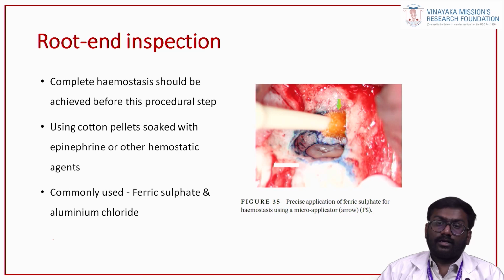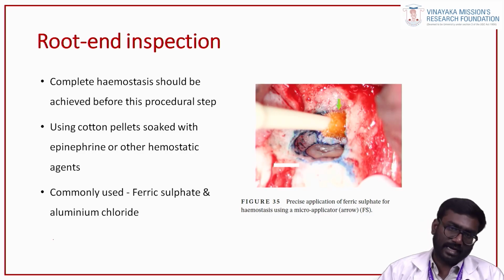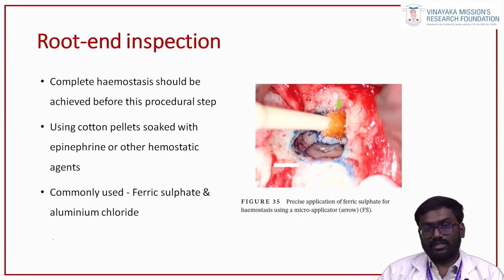So once the root end is resected and the cavity is curated, there should be no bleed. It should ideally be clean, so you can inspect that particular area. Complete hemostasis should be achieved before filling. You can inspect that area by soaking a cotton pellet with epinephrine, which is usually adrenaline. Have adequate hemostasis, because your filling material is not going to stay if it is constantly being wet by the source of bleed or saliva. So adequate isolation is very, very important.